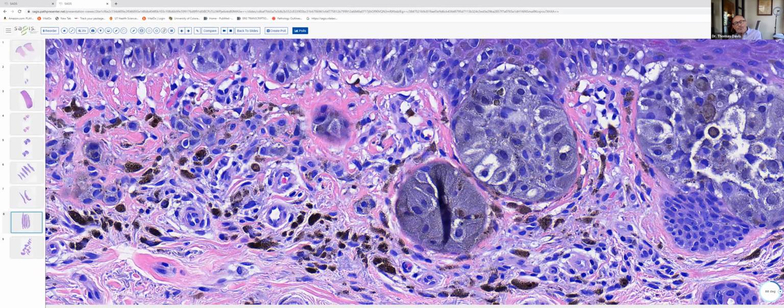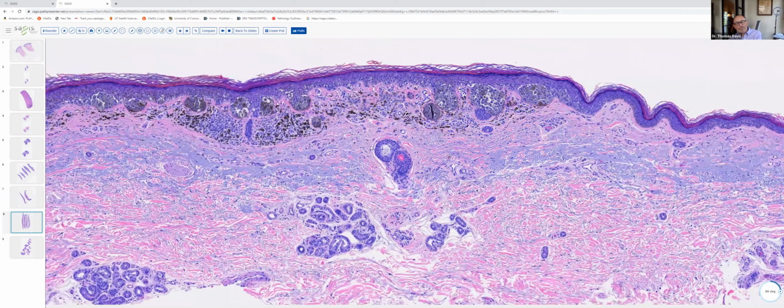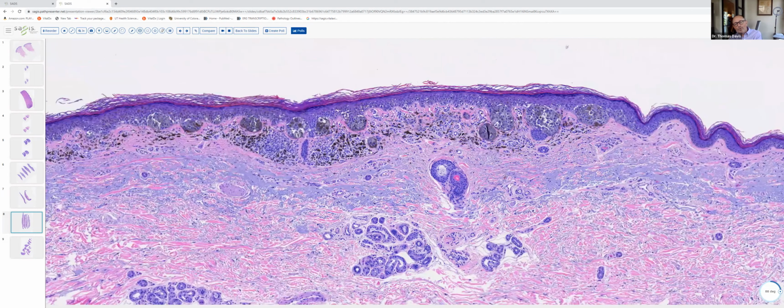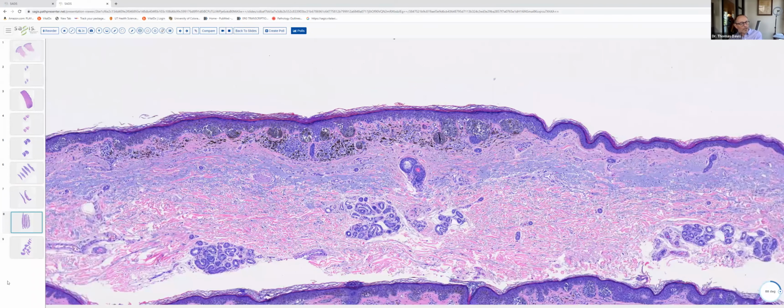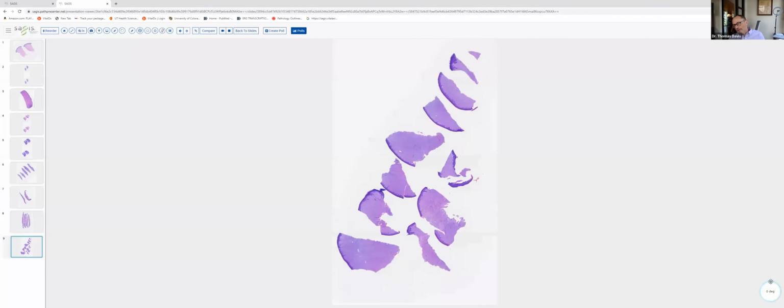Many of the cells also have prominent nucleoli. So in short, here we have a melanoma. This melanoma had a depth of about 0.4 to 0.5 millimeters, a superficial spreading type of malignant melanoma. Okay, we'll go ahead and close out with case number 9.